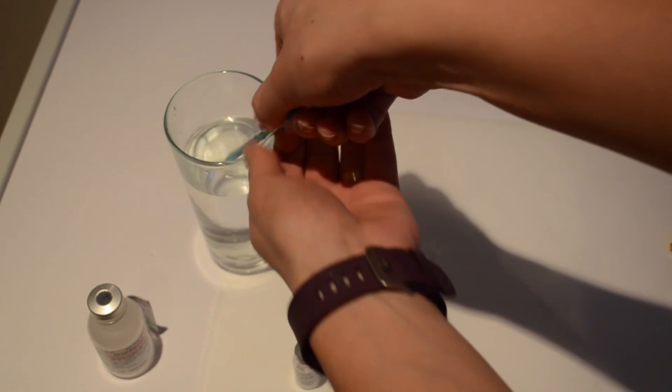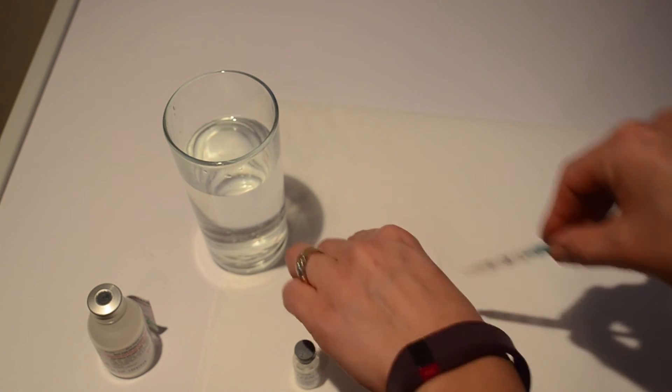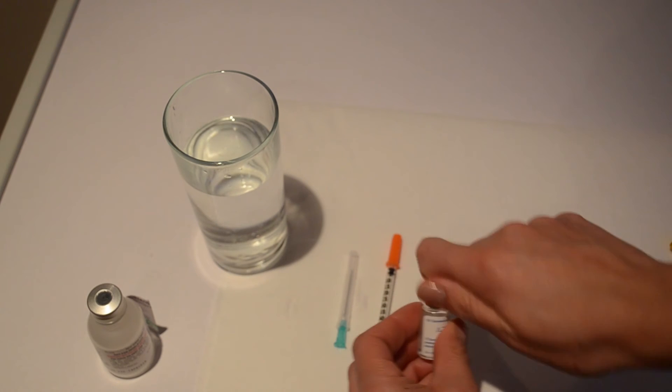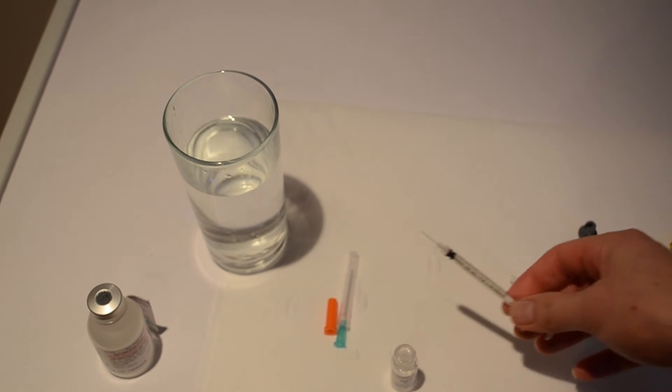So you're going to draw up your saline and you're going to put it with your needle into the bung. So once you've taken your cap off you can then draw up your AZZALURE.